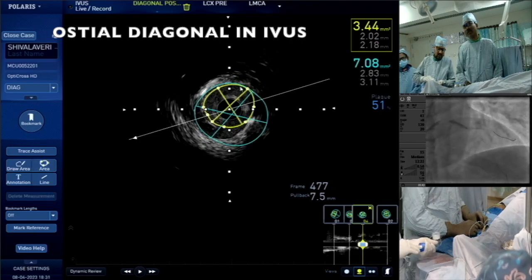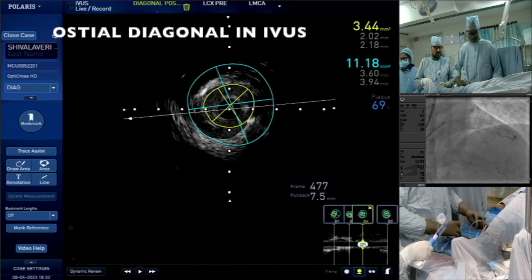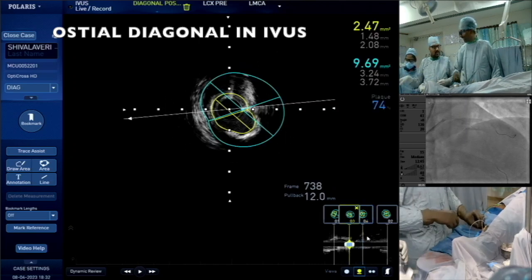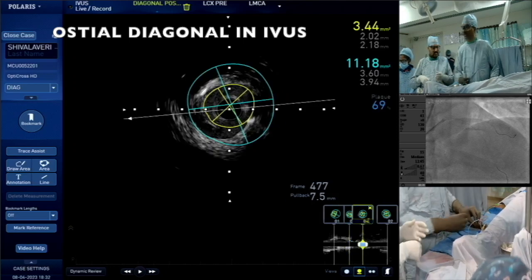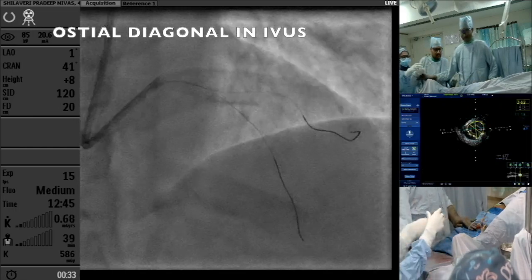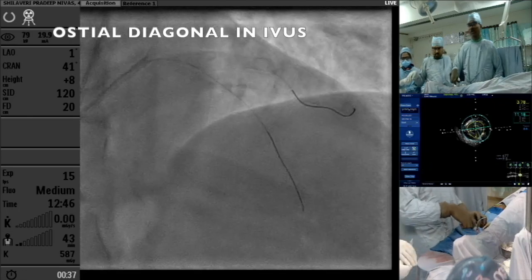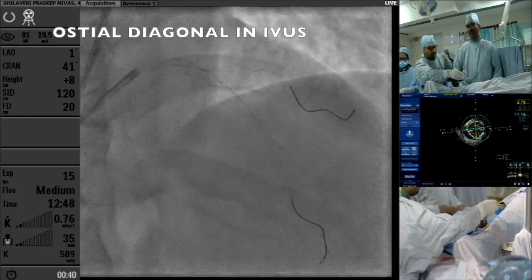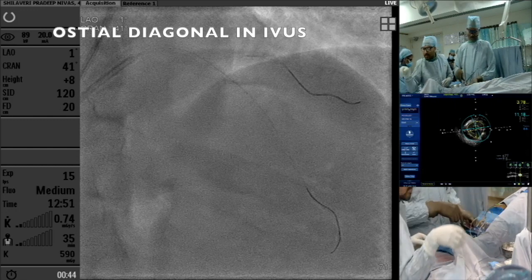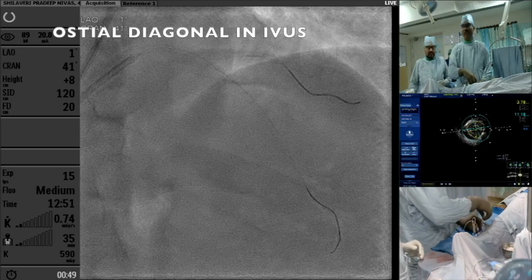6, 8. I mean, again, I'll just quote some data. You know what data says. I think it's 2.5. Anything beyond 2.5 mm square usually. Okay, give me some NTG, please. Okay, right. Give me some NTG, please. Now I think we have to move on.